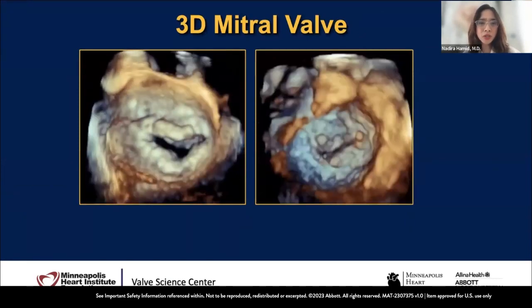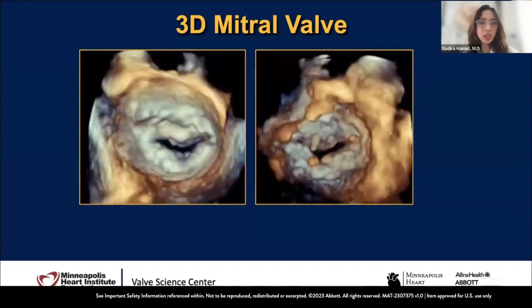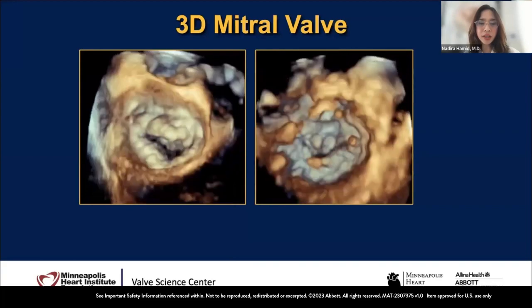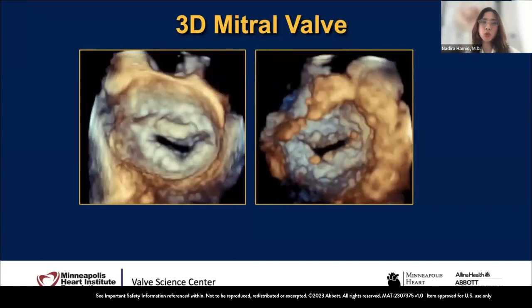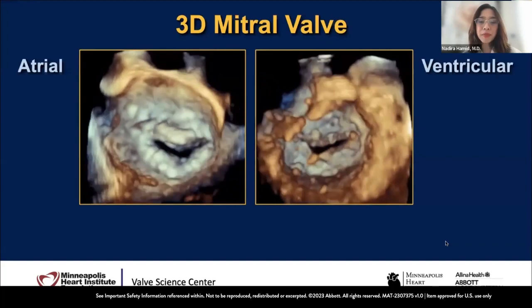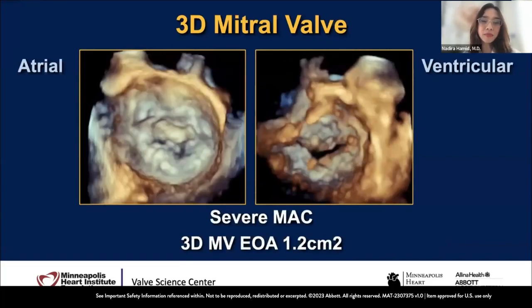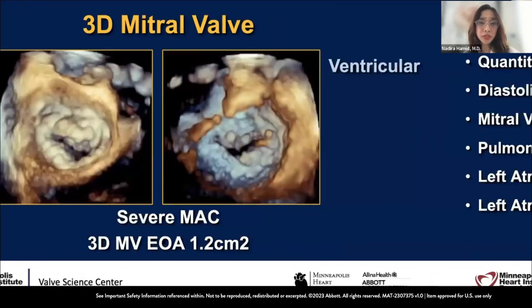And you can see this patient with, on the left-hand side, a lot of mitral annular calcification on the anterior and posterior annulus. And I flip it on the other side as well, the ventricular surface. You can see the opening, certainly just visually, is severe mitral stenosis. Absolutely not an indication for TEER, but I just want to highlight this dual layout and the severe MAC, and planimetry of the mitral valve certainly fits with severe mitral stenosis.